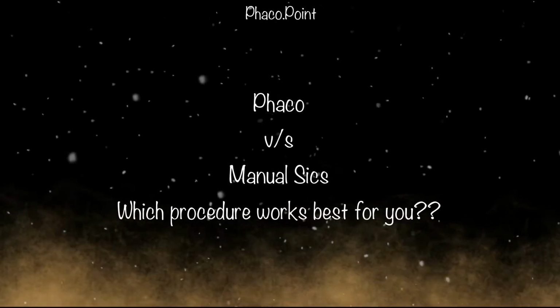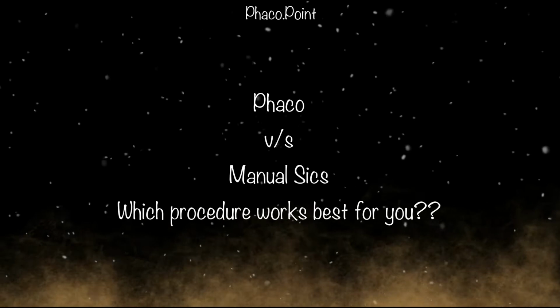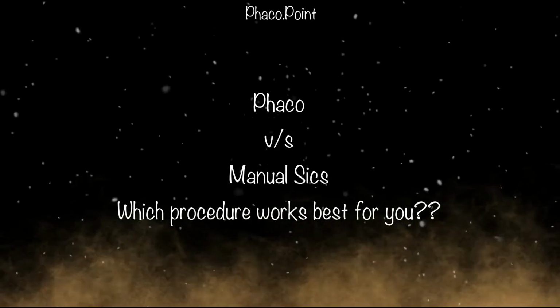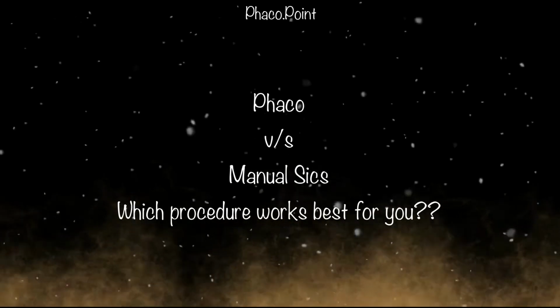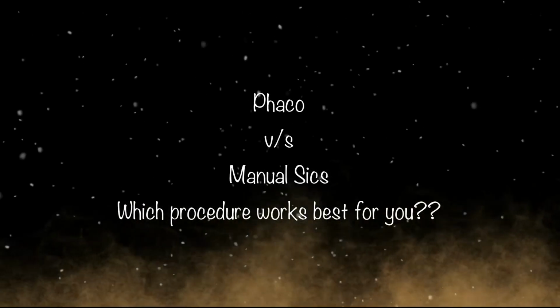The main reason for choosing a phacoemulsification here is that I'm not exposing the anterior chamber to the atmospheric pressure because I'm working in a closed system. In a SICS, when you're removing the nucleus, there's an increased chance, I would think, of having an expulsive choroidal hemorrhage. Let's now move to watching the surgical procedure.